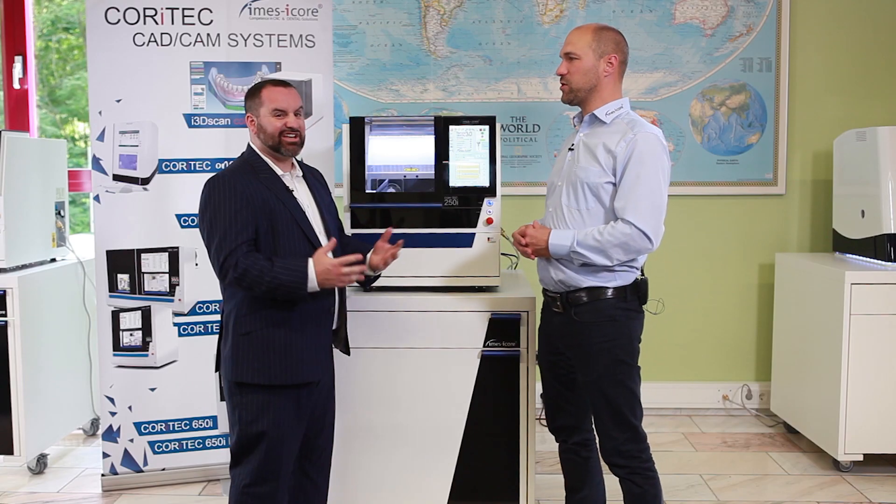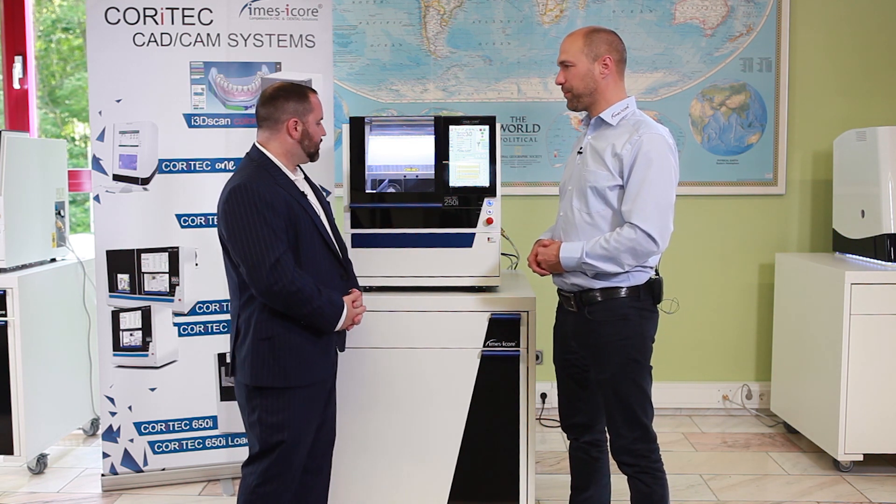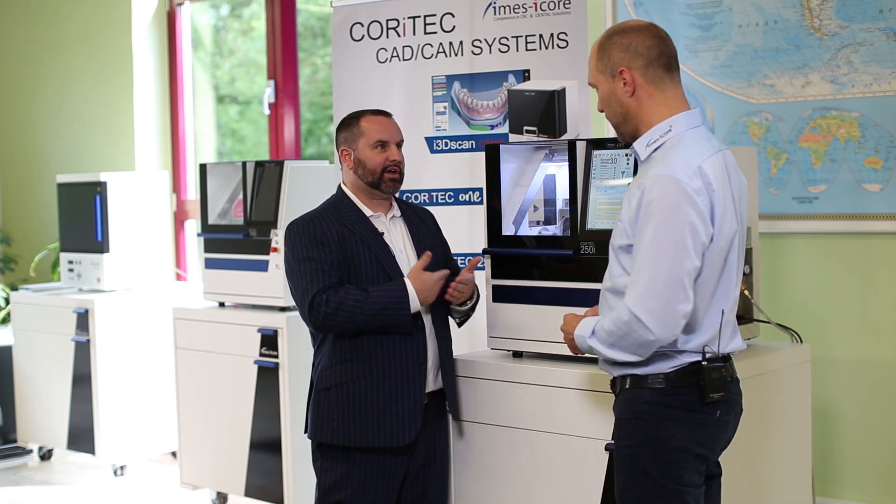So you give the customer the possibility to choose, and you're pretty much in any budget. Tell me a little bit more about the number of tools it will hold and things like that.